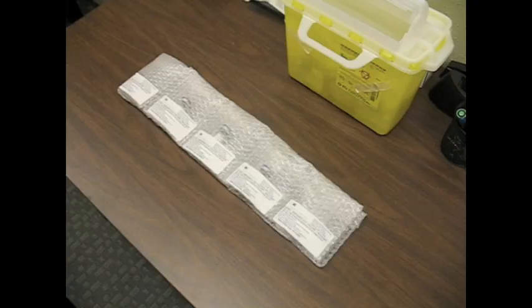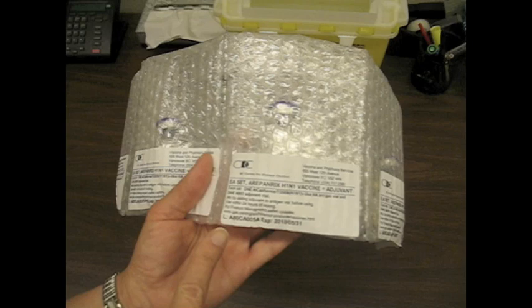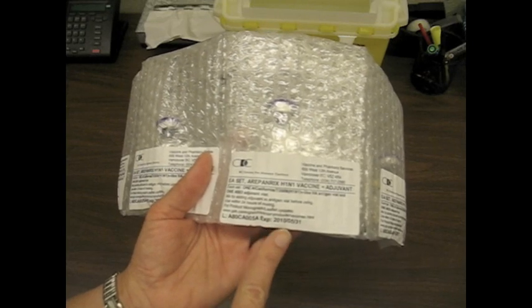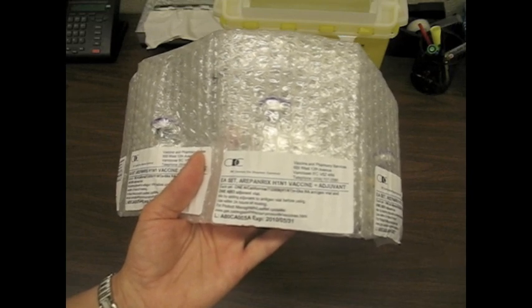Arapanrix H1N1 vaccine comes in two types of packaging. The first type is a bubble wrap containing 100 doses. The lot number for the bubble packaging is found on the outside of the package, and this lot number corresponds with the reconstituted product.